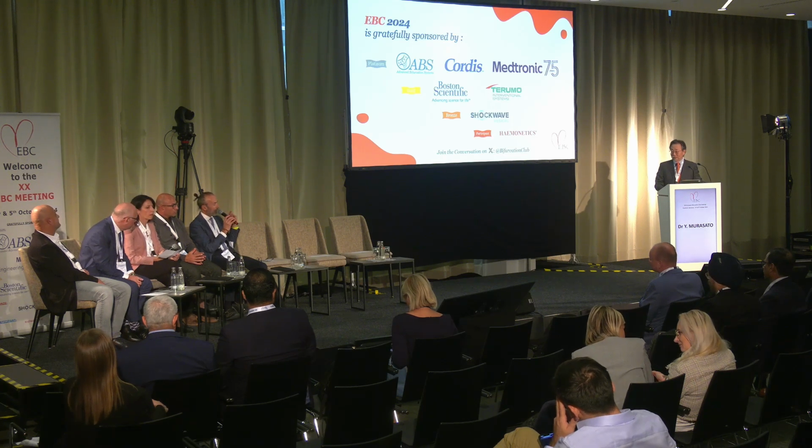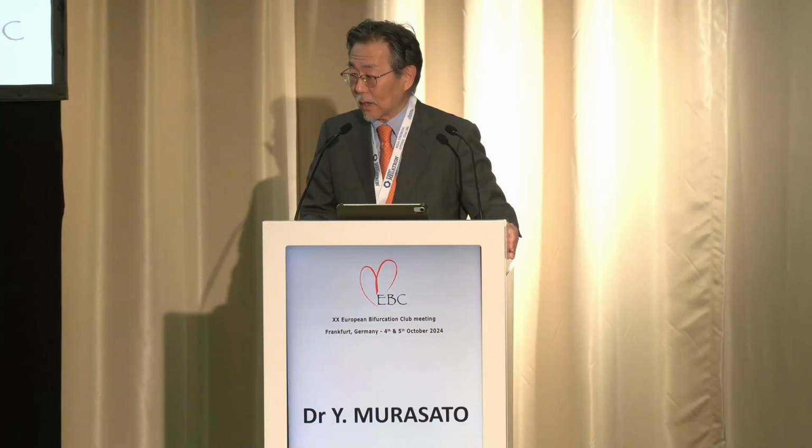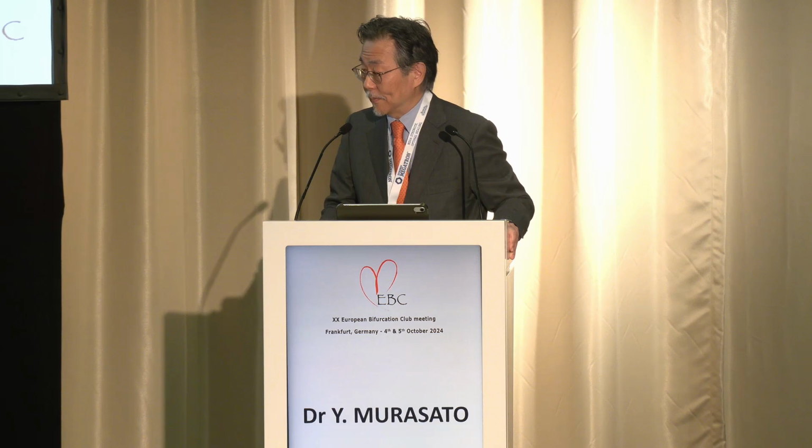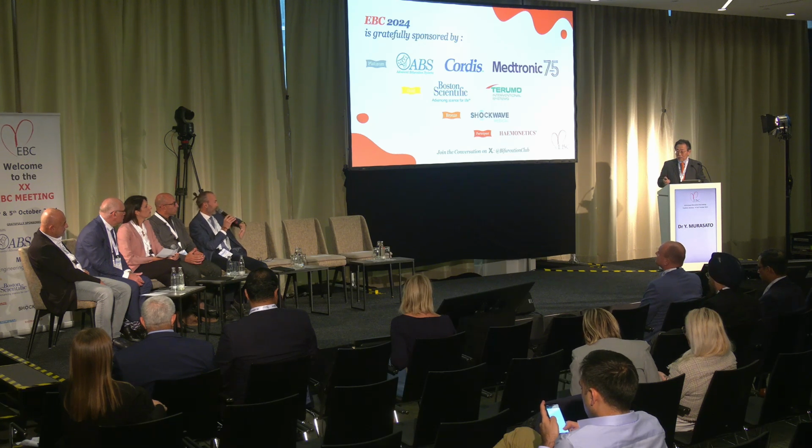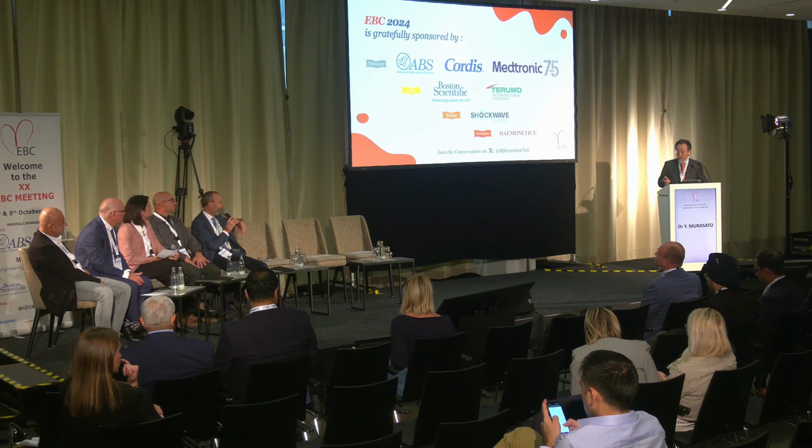Final question. When you do DCA on the LAD, the wire in the circumflex, do you remove the wire from the circumflex, or do you stay with the wire in the circumflex? You stay with the wire in the circumflex. The wire in the circumflex was not removed during DCA of the LAD, and the opposite the same, because you don't touch the wire with the DCA device.